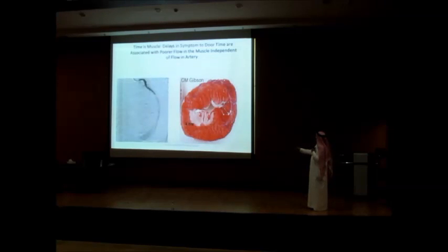But the problem is not here. The problem is in this artery. Very sluggish flow. And you don't see that blush because there is a lesion here and the small blood vessels are full of clots. So the contrast does not fill up the small blood vessels. There is very low penetration of the blood into the small blood vessels.